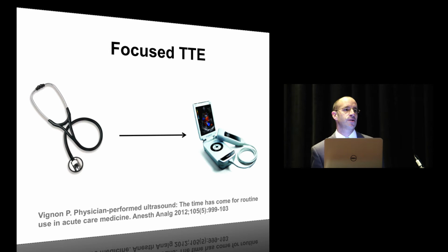So we're definitely evolving beyond that. And if we haven't adopted it, there's certainly other specialties that have. Emergency medicine reliably utilizes the technique. Critical care. Anesthesia, only really the cardiac anesthesiologist with TEE. But TTE is slowly but surely becoming an important part of anesthesia practice, and in OB is going to be no different.